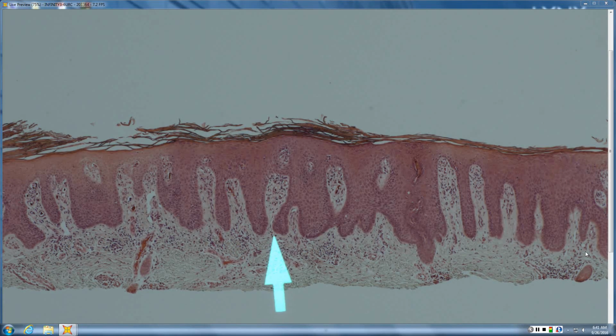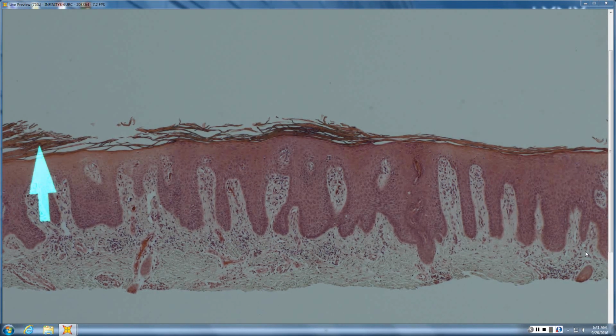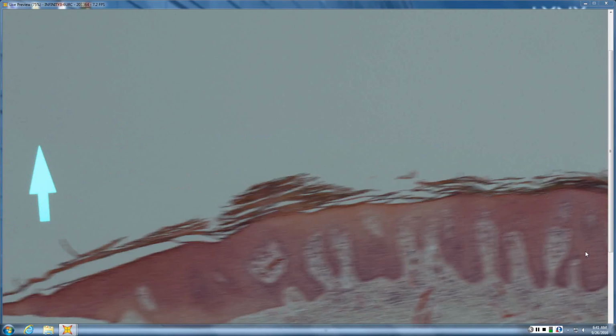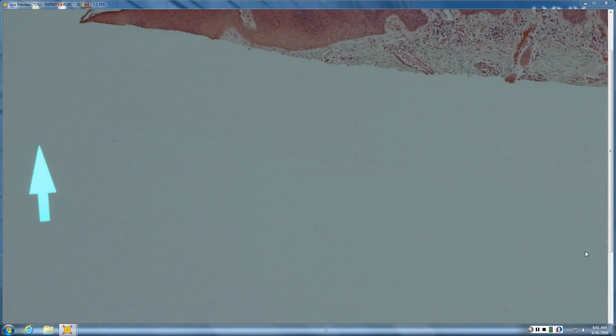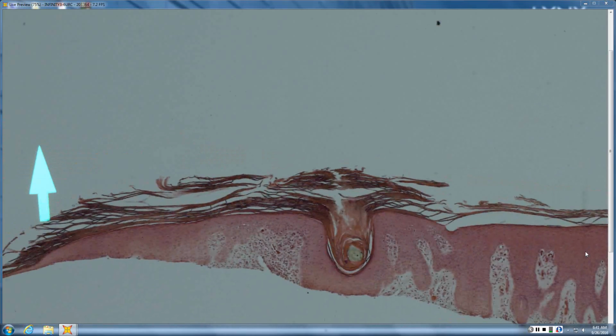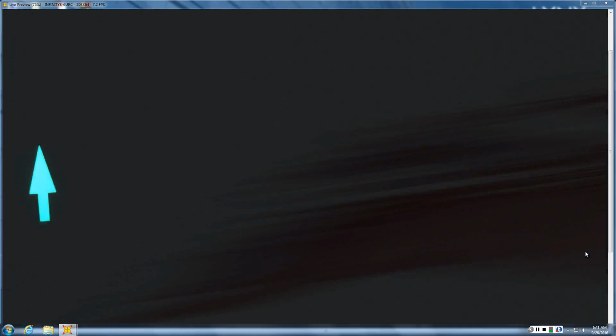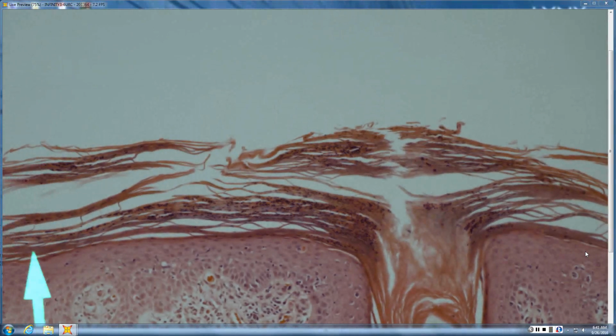So you see regular acanthosis. You want to see confluent parakeratosis with layering of neutrophils within. Now this one you would hope to be a little bit crustier. Let's see if I can look at the other cut. Find it. See, this area is a little bit more follicular, but if you get down in here, you can see that there is para. And again, this isn't the best ever.